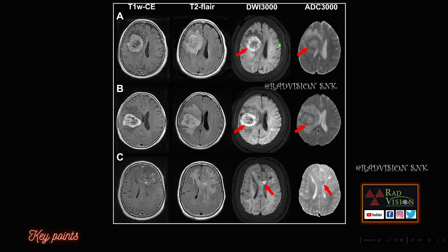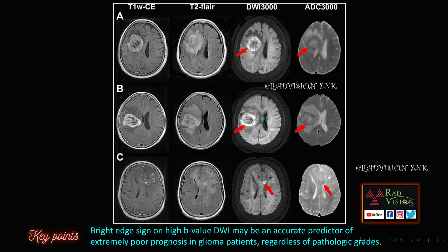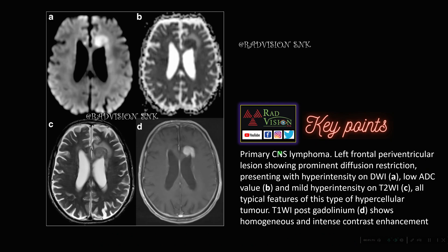Next: this was a case of glioma. Here you can see there is a peripheral bright rim sign noted along the glioma, seen when high b-values are used on diffusion weighted imaging. This bright edge sign or bright rim sign on high b-value DWI is an accurate predictor of extremely poor prognosis in glioma patients. Whenever you see this bright rim sign, it predicts poor prognosis of the glioma regardless of the pathological grade. Remember the bright edge sign as a predictor for poor prognosis in gliomas.